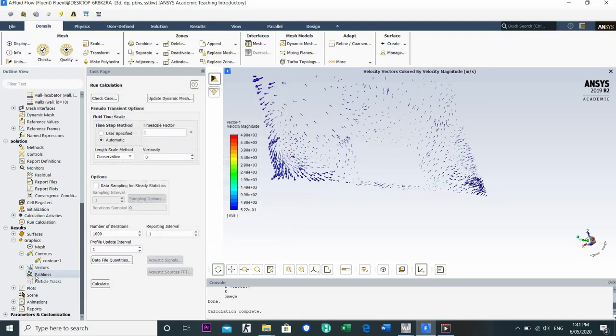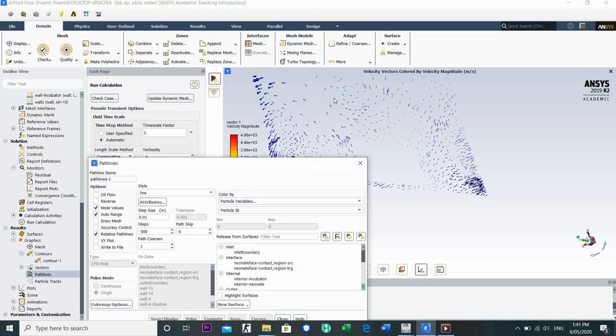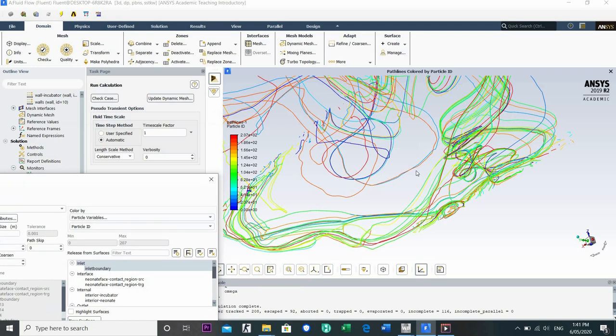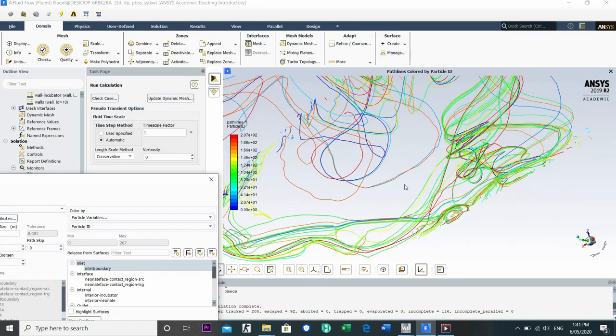Okay, the next one is the path lines. Path lines are released from the surface inlet boundary, then save and display. So it looks like this.